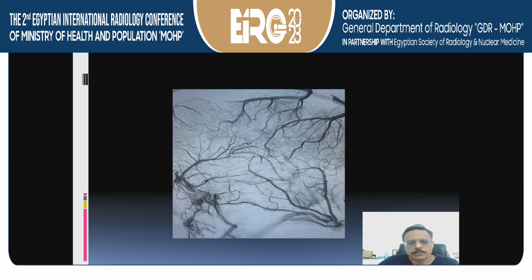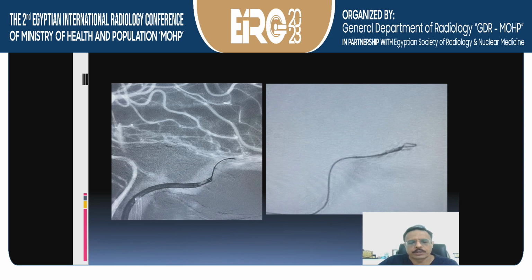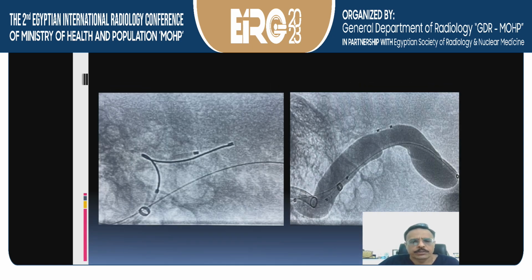And you can see some veins were opening near that side of the fistula. So sometimes we can do transvenous catheterization and a balloon, and then control the flow. This is what we have done. One microcatheter was placed into that sac which opens in the wall of the sinus. So it is important to identify that sac using 3D imaging.